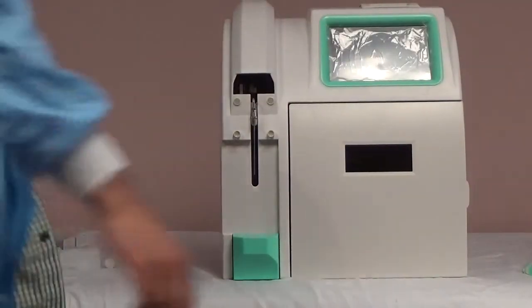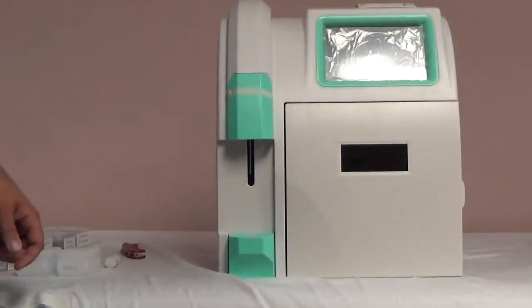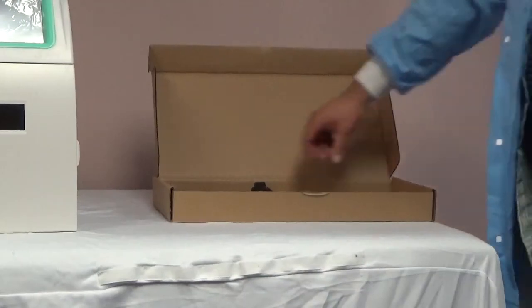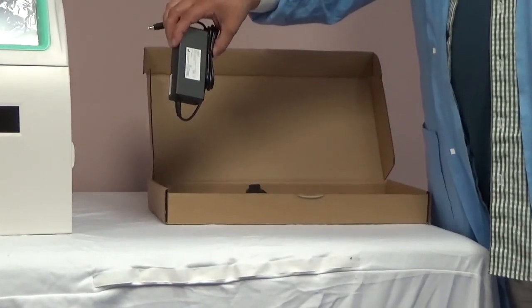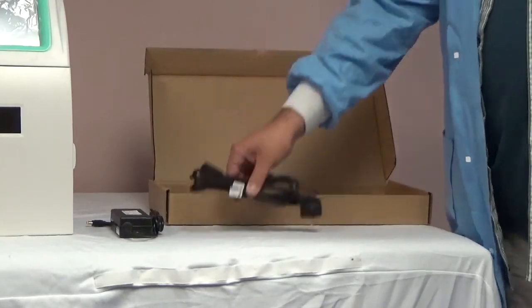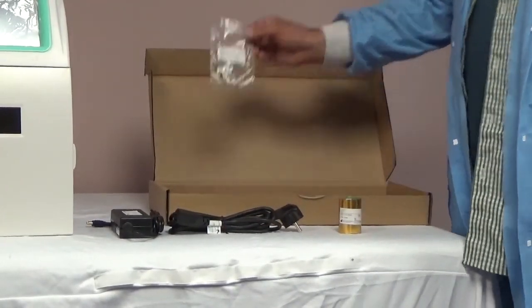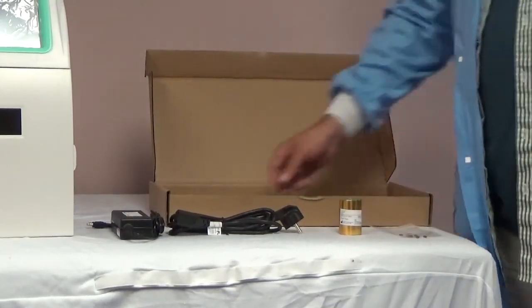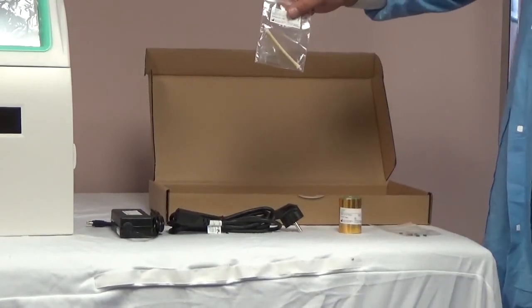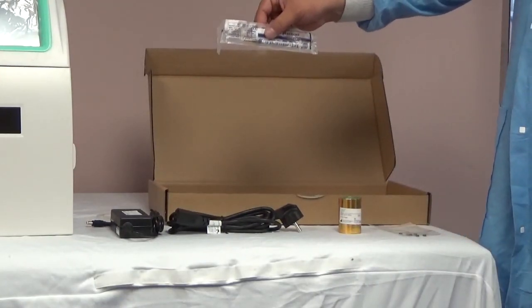Attach any of the magnetic pieces if they are not already in place. Next, you can begin to remove the accessories from the box. Make sure you have each of the following parts: an AC adapter, power cord, printer paper, O-rings, pump tubing, and a blockage removal needle.